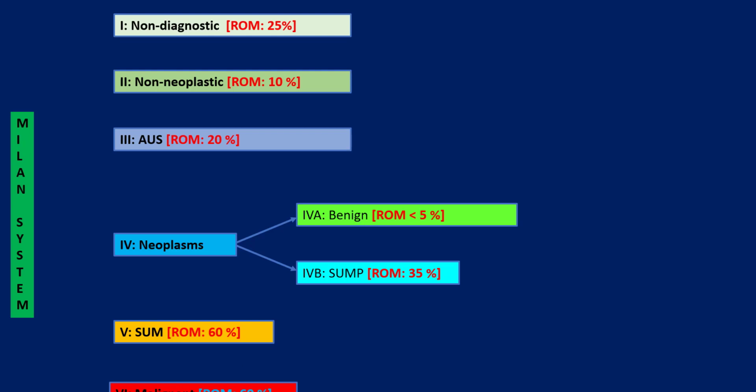So that's something which we should keep in mind as far as we are concerned. So when you are using these particular categories, I think I have made a mistake here. This is possibly much, much higher. But anyway, so that's where we go to now.